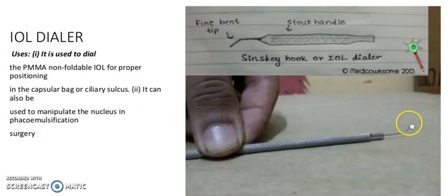It is an IOL dialer. It has a fine bent tip attached to a stout handle. Its usage: it is used to dial the PMMA or non-foldable IOL for proper positioning in the capsular bag or scleral sulcus. It can also be used to manipulate the nucleus in phacoemulsification surgery.